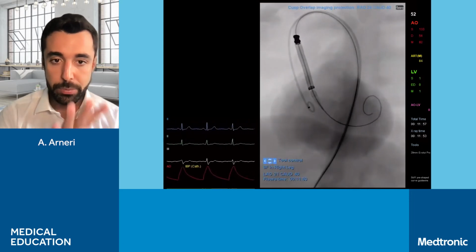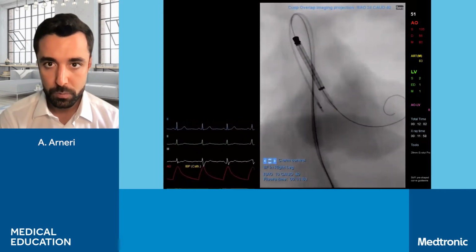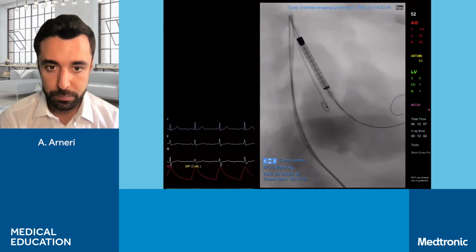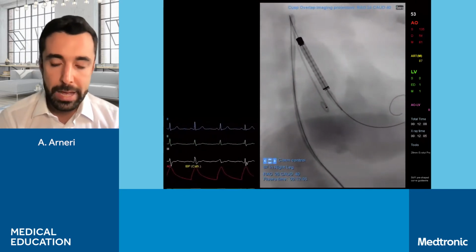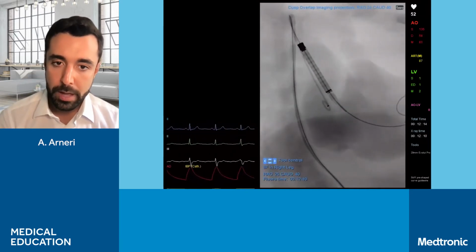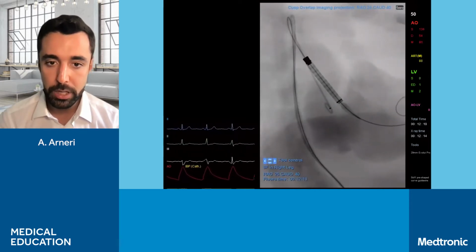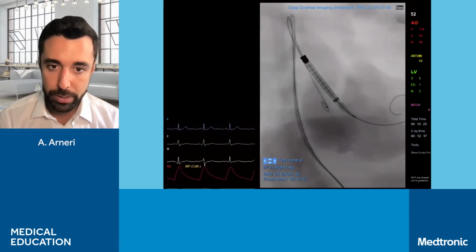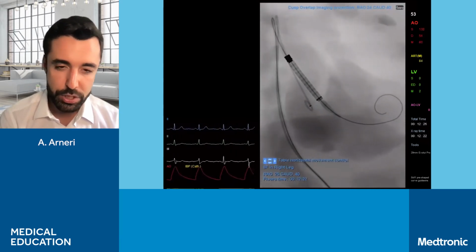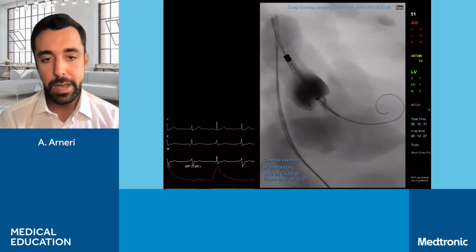Okay, we stop here and we go back to our cusp overlap view, which was a right 24, caudal 40. And our starting point is going to be with the radiopaque marker at mid pigtail, so half of the pigtail. Okay, we stop here. So we see that we have our radiopaque marker at mid pigtail. We can do a contrast injection just to check if the pigtail is still in place before starting with our implantation. And I think we can start.